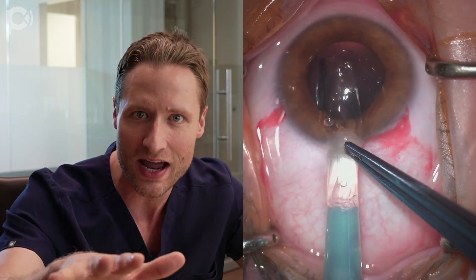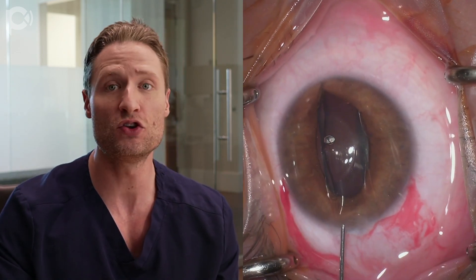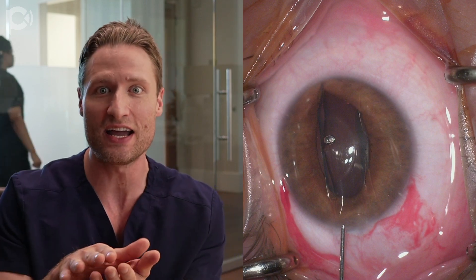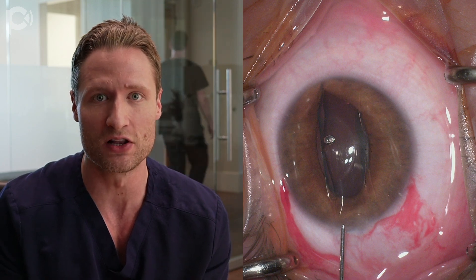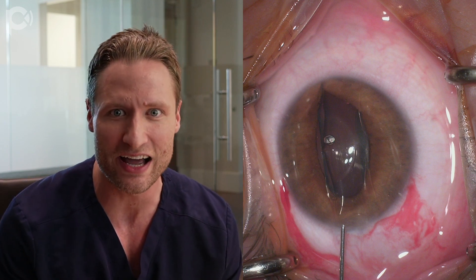As I put the injector into the eye, the iris suctions up against the back of the injector. The lens is being injected but it's caught up in the iris — I'm pushing and it flips open, disengaged from the iris. The lens is now delivered into the anterior chamber, but rather than opening and unfolding beautifully, it's tacoed on itself — folded in half. The risk at this point is if you indiscriminately put viscoelastic in, the lens can unfold upside down, which is a disaster requiring explantation or an in-eye flip.